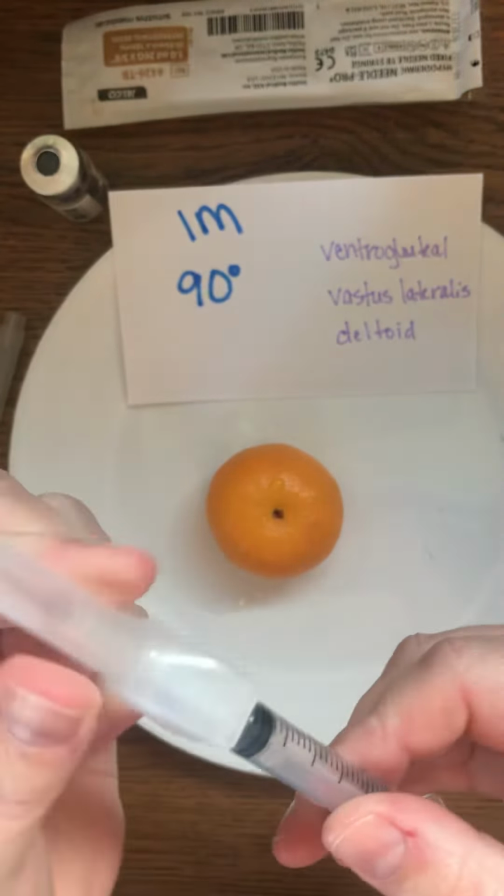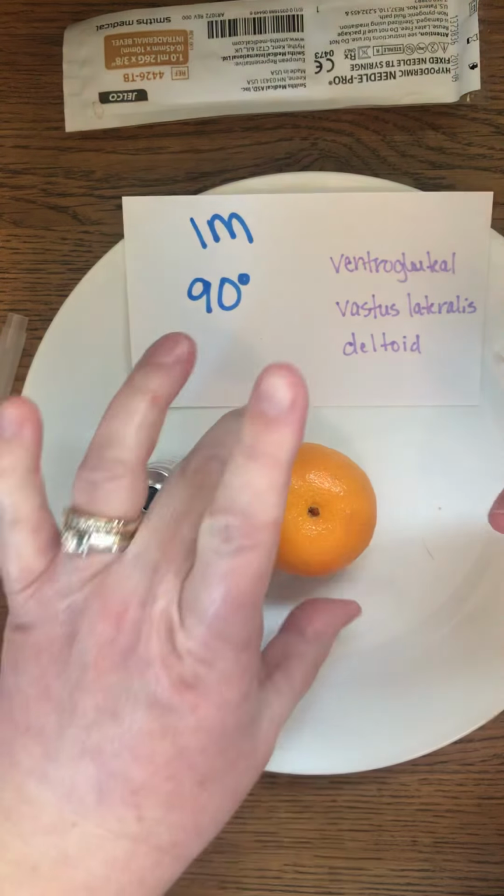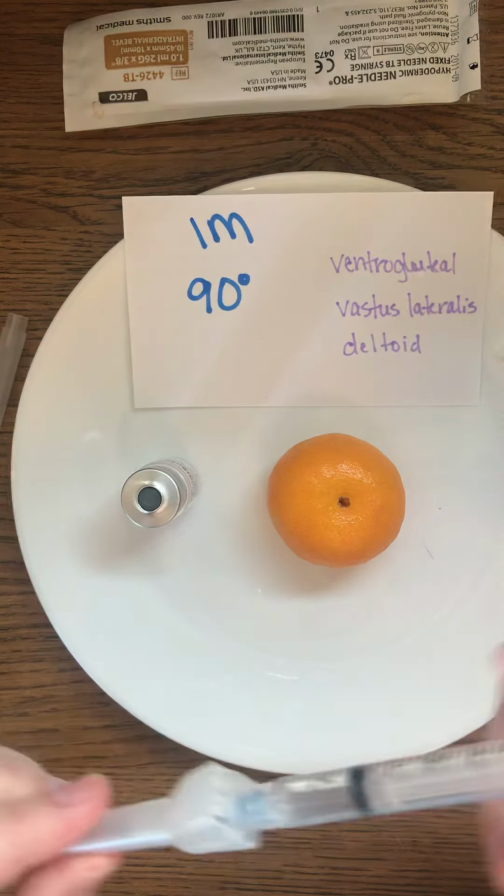And remember, you want to locate your landmark first, and then you're going to clean with a rotating clean, starting from the center and moving out. You don't want to go back in once you've gone around and gone out, because we don't want to pull any germs back into that area. Okay, so that is clean.